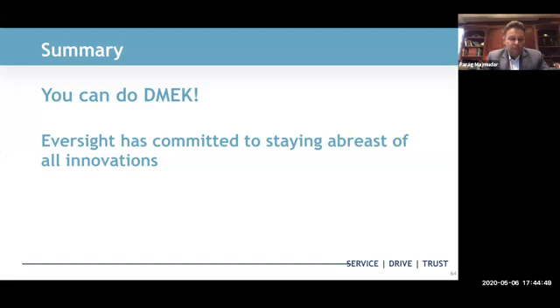But I don't like to leave the air bubble completely full with a firm pressure for too long, about 5 minutes, and then just leave a moderately sized air bubble. What I really don't want to have is a pupil block in the middle of the night. I'd rather rebubble because I've become very comfortable rebubbling. I can rebubble somebody in the office the next day very easily, as opposed to having them be uncomfortable at 1 or 2 in the morning and they call me and I go in. I've had to do that in the past.